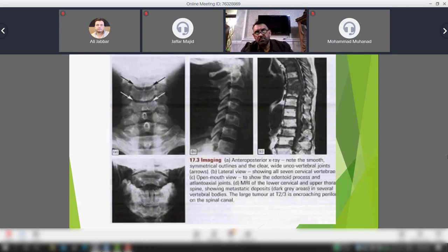Headache and tension. How to read the X-ray? Same issue as for the lumbosacral spine. Plain X-ray of the cervical spine, labeled by date and name, shows the lateral aspect. Where do you look? You look at the anterior edge of the spine, then the articulation of the vertebrae over each other, and then the posterior line of the spine and then the spinous process, the posterior complex.